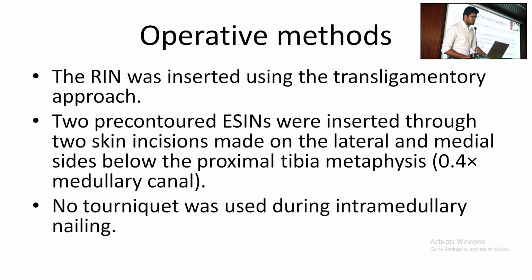And operative methods: the rigid intramedullary nail was inserted using the transligamentary approach. Two pre-contoured elastic nails were inserted through two skin incisions made on the lateral and medial sides. No, sir, patellar approach, sir. The patella is split. Yes, center, sir.